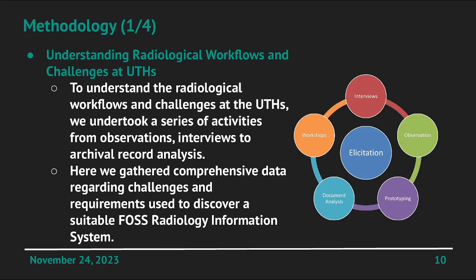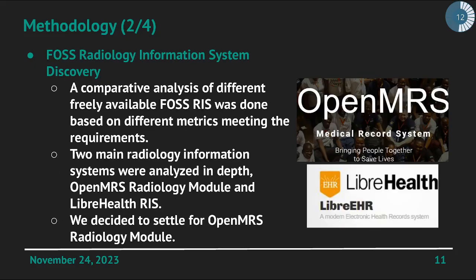We began by understanding the radiological workflows and challenges at the UTHs. To do so, we undertook a series of activities from observations, interviews, to archival records analysis. Here we gathered comprehensive data regarding challenges and requirements used to discover a suitable FOSS Radiology Information System.